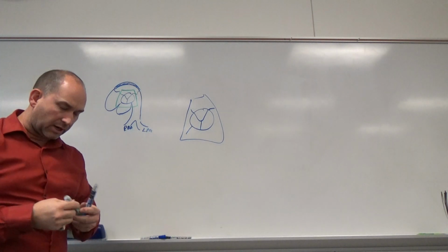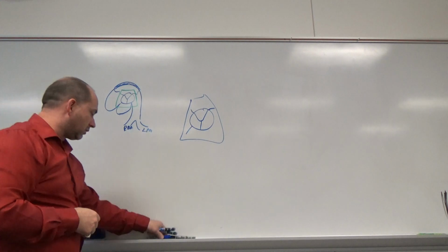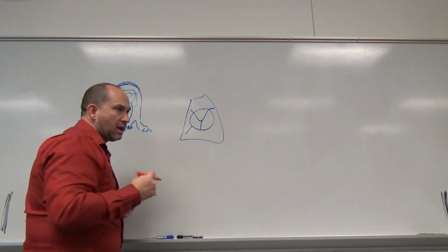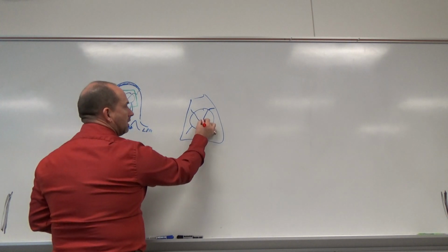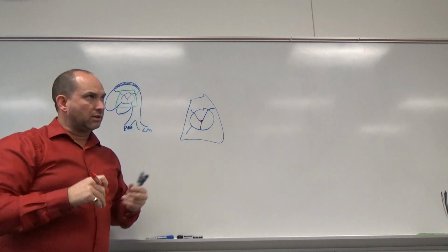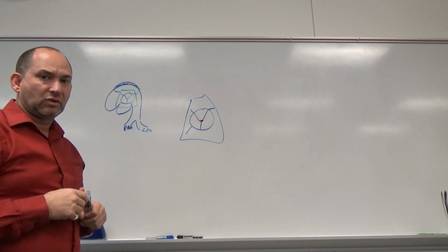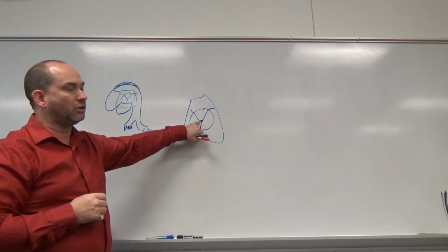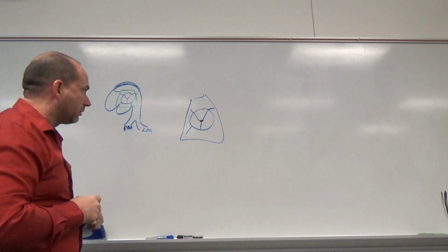What we're looking for in color Doppler on this, so we're going to do this in a 2D clip first. Then we're going to do a color Doppler on it. If we have a regurgitation on the valve or a leaky aortic valve, it's typically in the center of it right there. And you're going to see just on the ascending aorta side of the valve, so if you sweep it up just slightly, we're going to get a little residual aliasing effect that lasts throughout diastole.